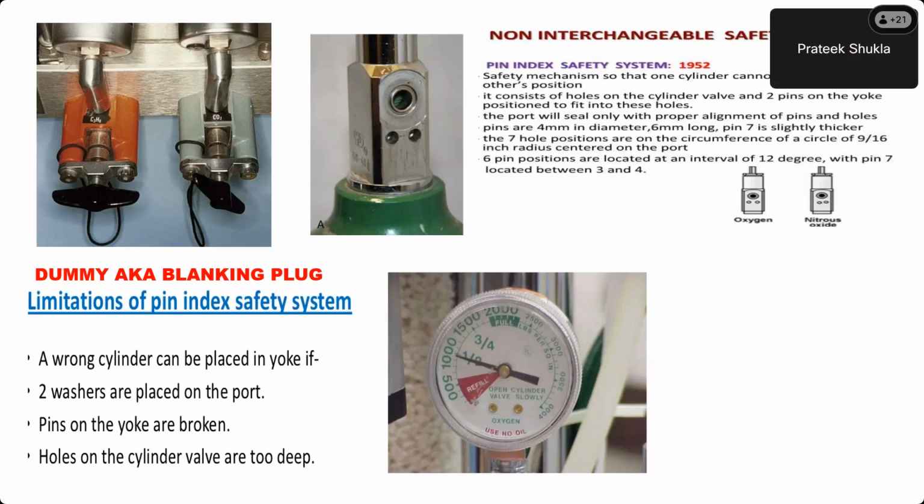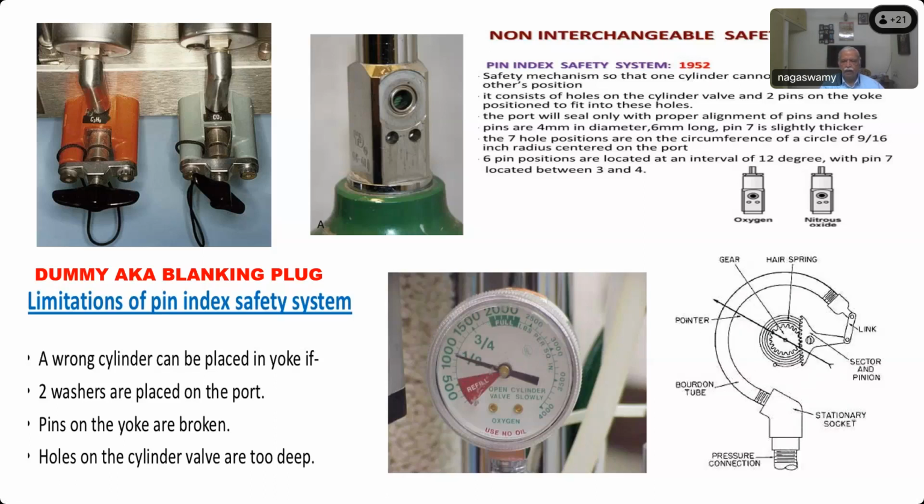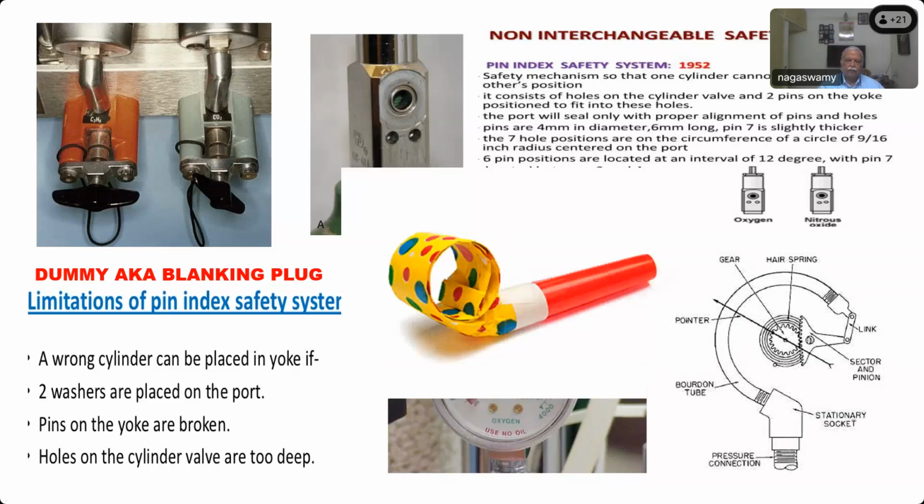Color coded it comes in. See, the name of the gas for which you have to use is written here. There is an instruction, use no oil, and there is a warning signal that you have to replace the cylinder if the level of the needle comes down here. It shows full cylinder pressure here, 2200 or 2000 roughly, and usually it is a white color indicating the color code. Units are written in pounds per square inch; nowadays you get it in kilogram per square centimeter. Okay, so that is the unit, and this is the inner picture of how this whole thing works, and it is simple.